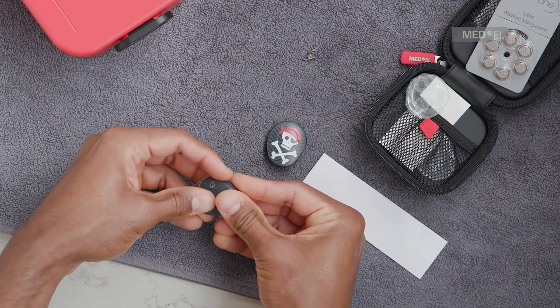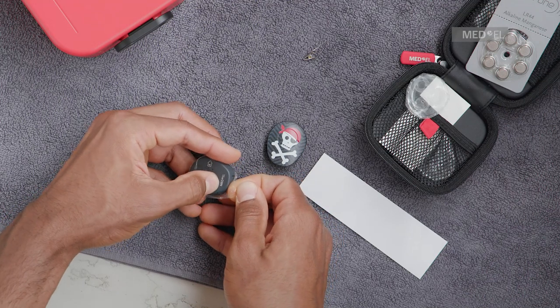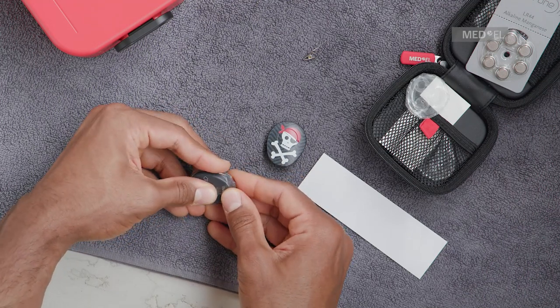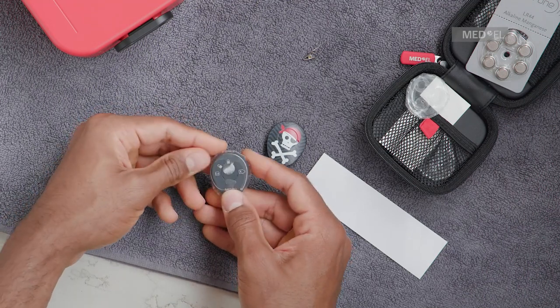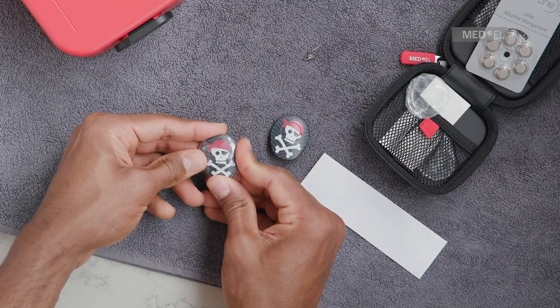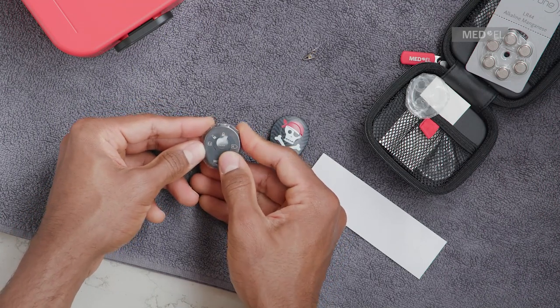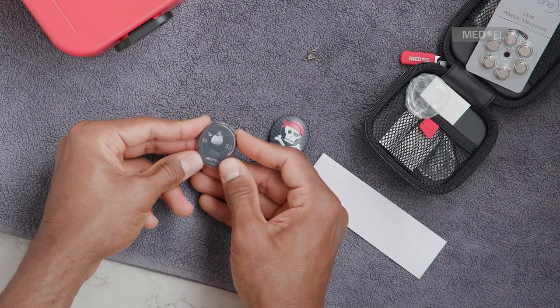Hold Samba 2 and grab the rectangular shaped flap with your other hand. Pull Waterwear over the entire processor. It will form a tight fit, so you may experience some tension while pulling Waterwear around the audio processor. The overlap should be evenly distributed around the edge.